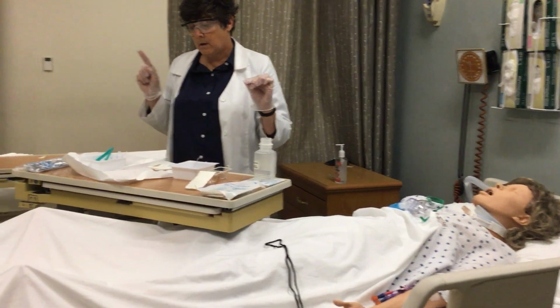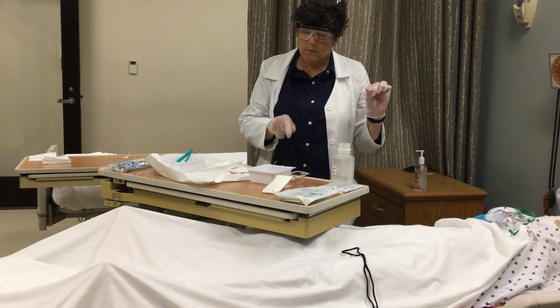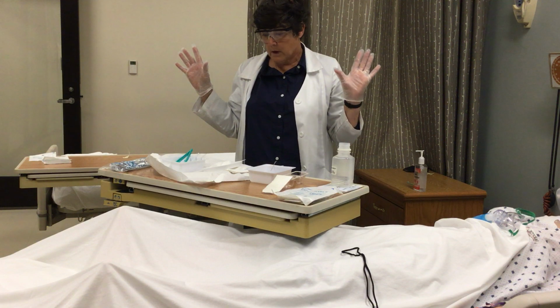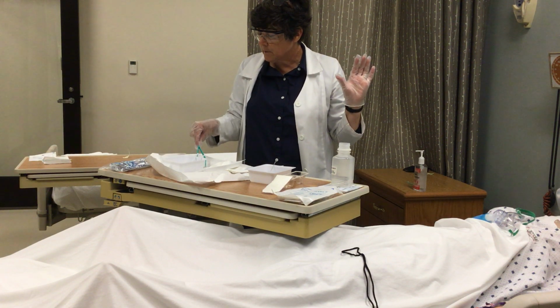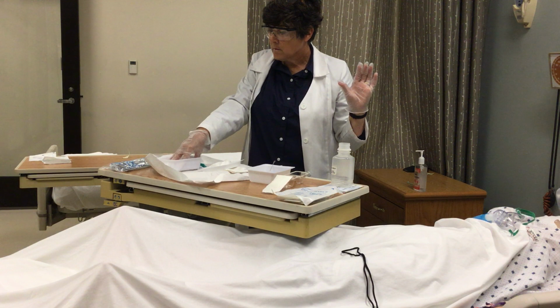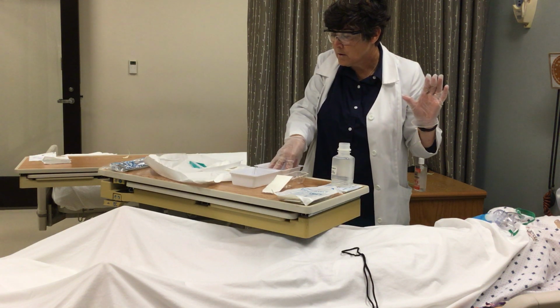So that means I need a new basin for additional saline, because this one is considered dirty since I've cleaned the inner cannula. I have one sterile hand, one non-sterile hand. So what I can do is take out these items I'm not currently using. I'm going to stick my hand in here, bring it over.